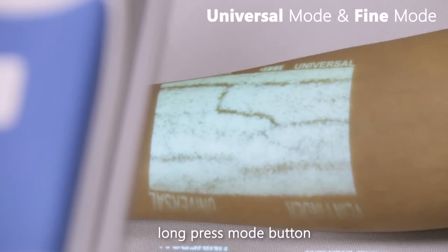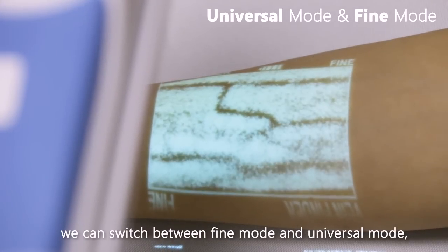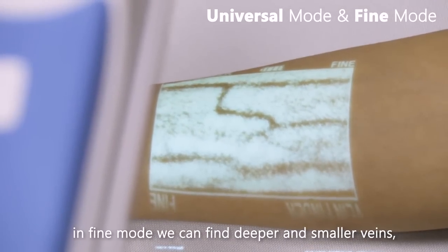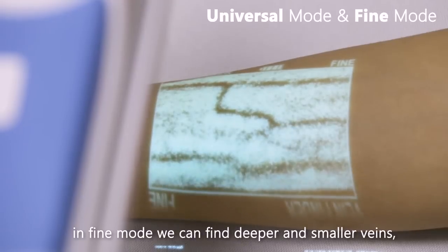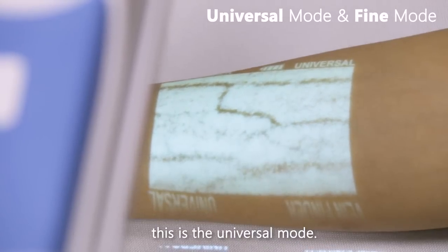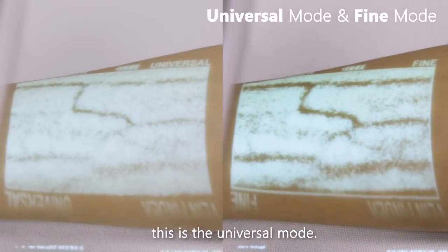Long press the mode button to switch between fine mode and universal mode. In fine mode, we can find deeper and smaller veins. This is the universal mode, and this is the fine mode.